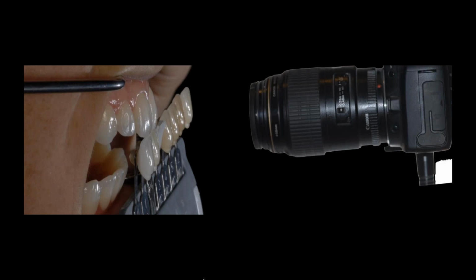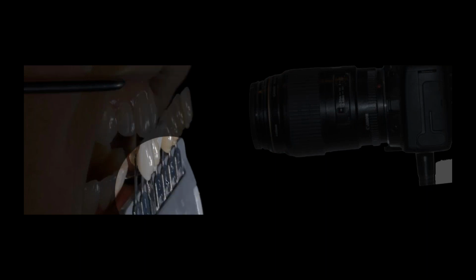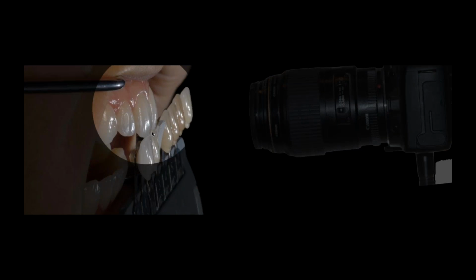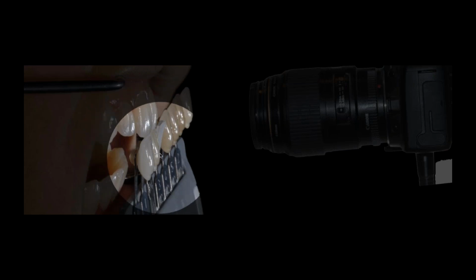And what I highly always recommend is that not only is the flat of the patient's tooth even to the flat of your shade guide, and then even to the flat of your camera. I want all those things to line up together. I'm a fan of incisal edge to incisal edge for shade taking. The eye sees color better in vertical lines, not in horizontal lines.